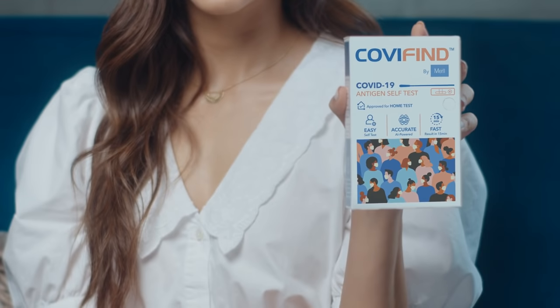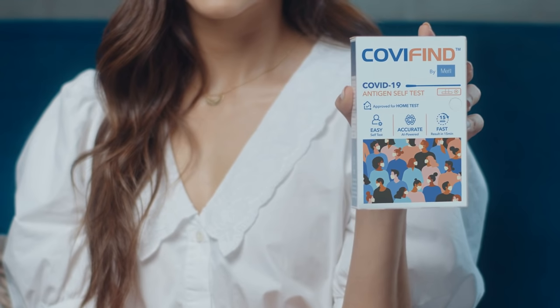So what is the CoviFind Rapid Antigen Test? This is a self-test kit and you can do this from the comfort of your home. Let's get to it, shall we?